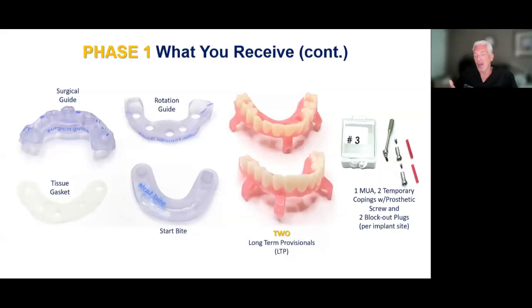Ideally, you pick them both up on the same day. The reason for that is it gives you a backup, so if something were to happen and they break one, you have another. Also, when it comes to the restorative for the final, it's a modified way instead of going the conventional route to get to a final. It saves appointments and makes it a more simple procedure.